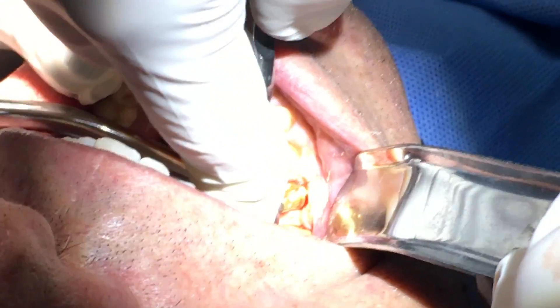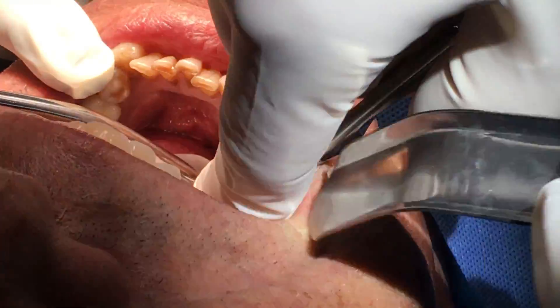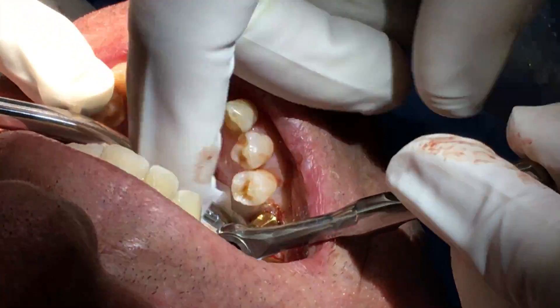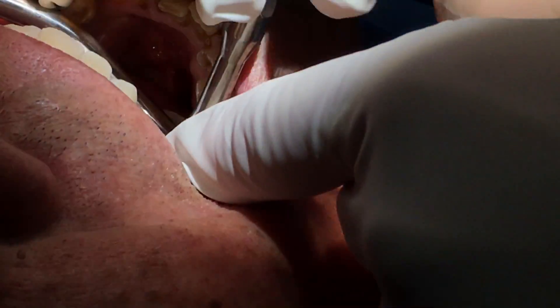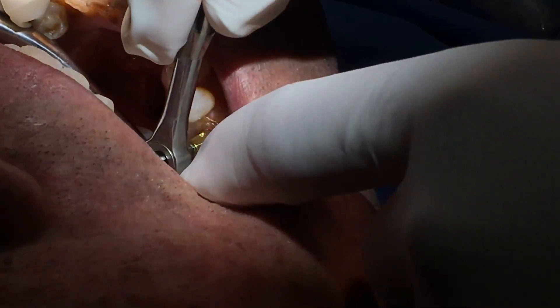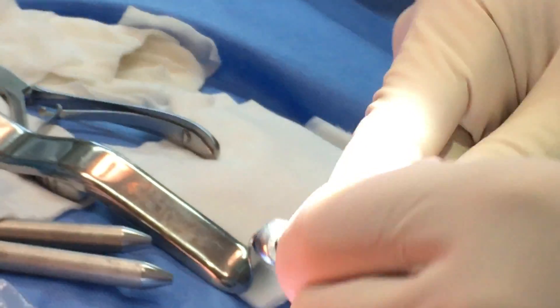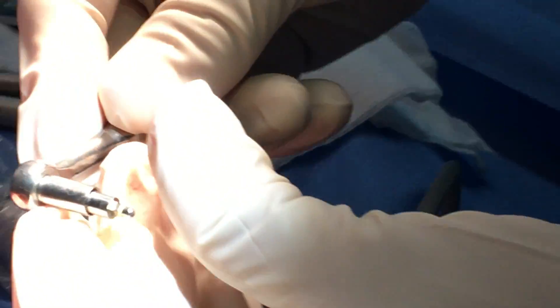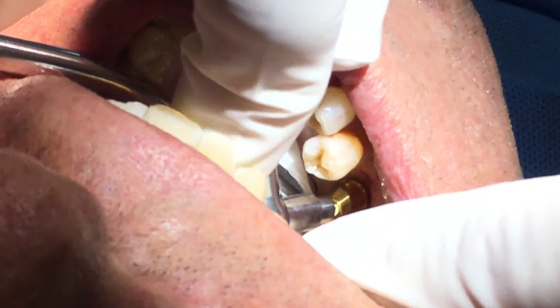I'm just going to finish the final positioning with my hand. Can we have the extension please? Can I open a little bit more?